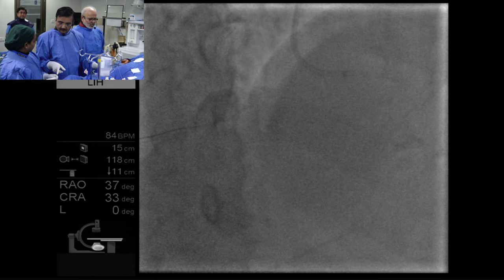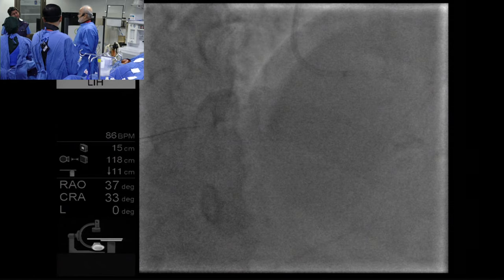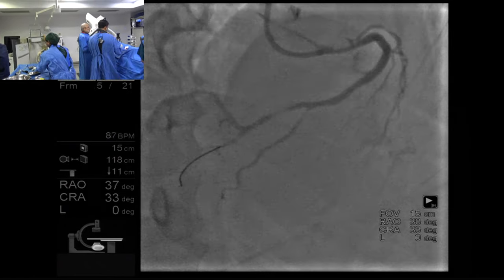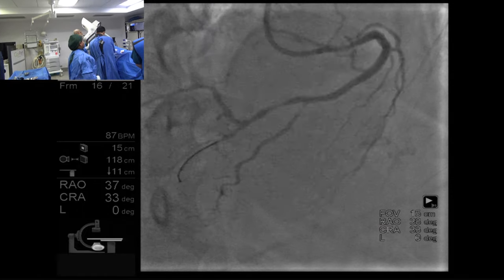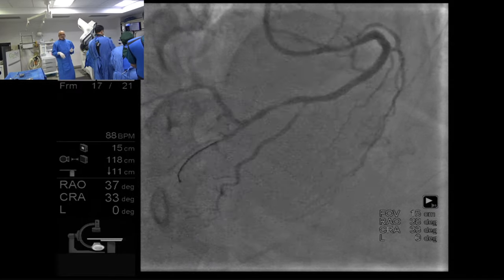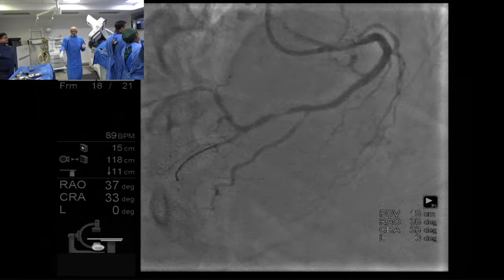Again, I am using a non-compliant balloon, keeping in mind there is some good amount of calcium, because it was there on the left side. There was a stenting effect also. Okay. Sanjay has a different opinion. He says that 2.5 by 8 may slip here and there if the fibrosis is more, so we can take 12 millimeter. Yep.